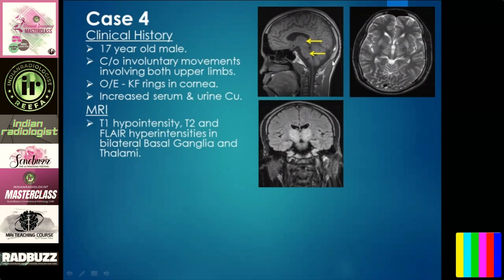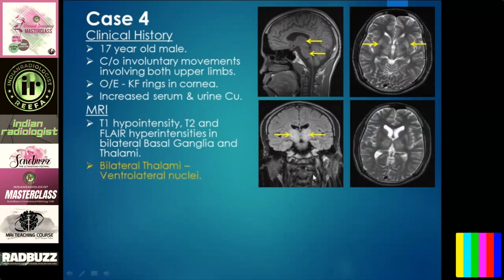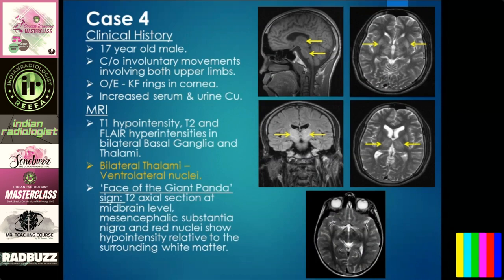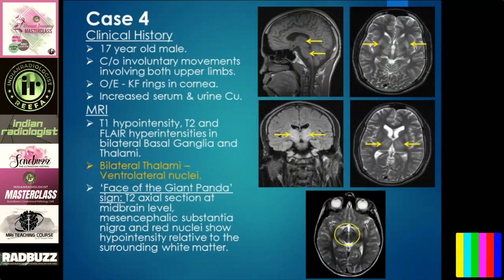On MR imaging, you see T1 hypointensity, T2 hyperintensity, and FLAIR hyperintensity in the bilateral basal ganglia and thalamus, most commonly involving the ventral thalamic nuclei. Then you see the famous sign — the face of giant panda or double panda sign, classically seen at the midbrain level where the mesencephalic substantia nigra and the red nucleus show hypointensity relative to surrounding white matter. This is a classical case of Wilson's disease. Key findings: T1 hypointensity, FLAIR and T2 hyperintensity in basal ganglia and thalamus.